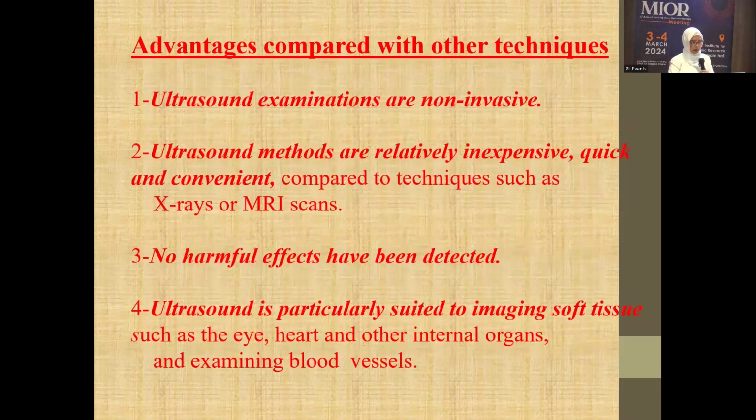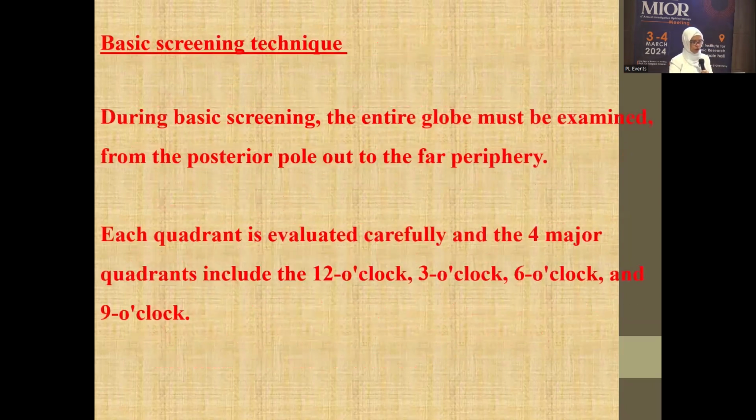another B scan. Advantages: we know that ultrasound is non-invasive, it is not harmful, the method is relatively inexpensive, it's very quick, and ultrasound studies the image in the soft tissue. All of this is the privileges for the ultrasound.